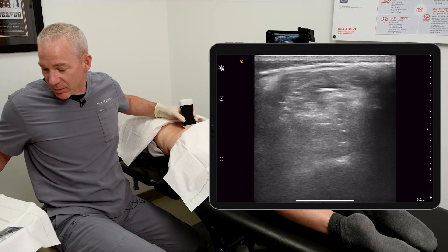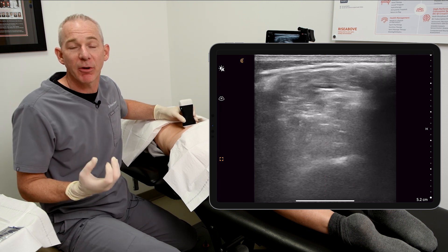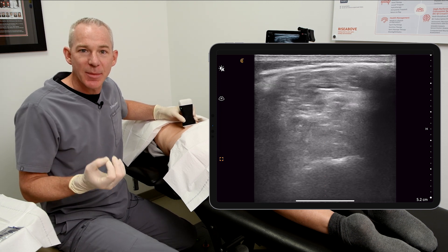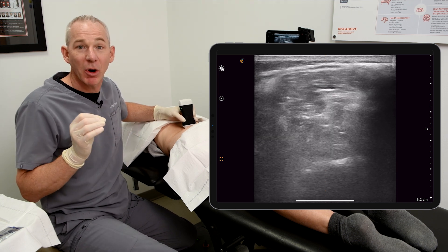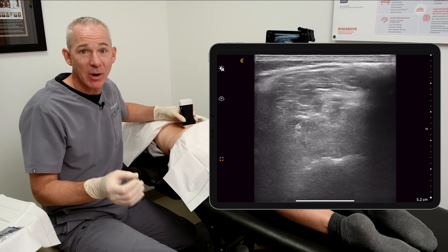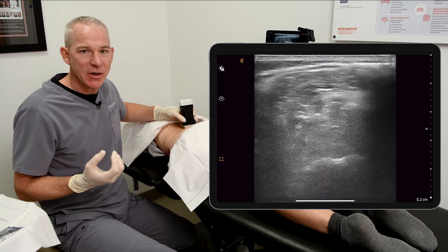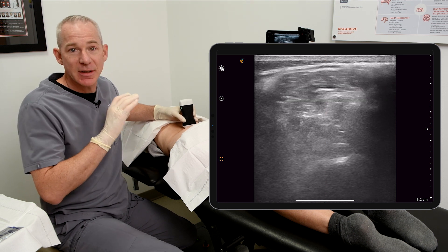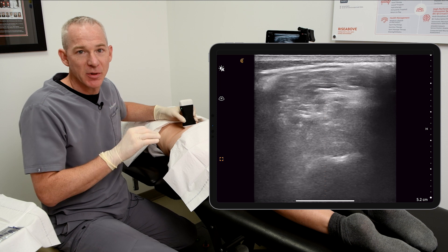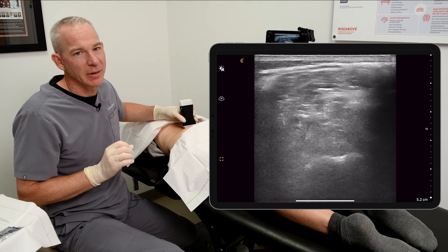And that's the treatment completed. I wasn't able to see the needle perfectly all the time. A lot of times in ultrasound, you can't see the needle perfectly. The beauty of this is it can tell me where I wasn't — I wasn't anywhere near the epidural space, and I wasn't out laterally near the transverse process where I risked traveling into the abdomen. Very safe procedure using ultrasound. The linear probe did a great job. The curved probe would probably do anything better.